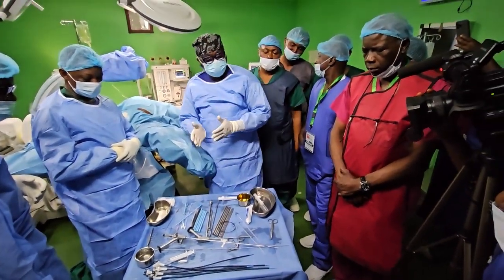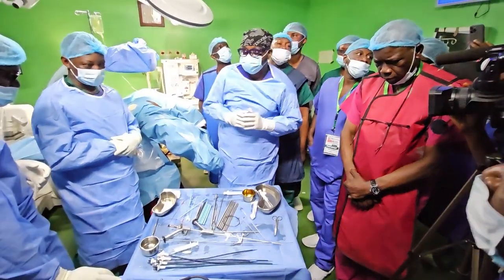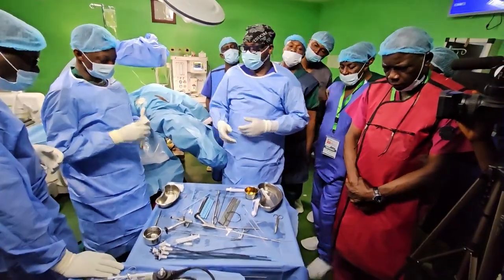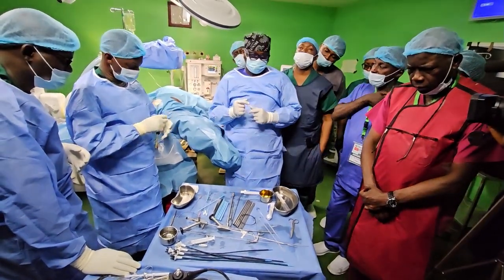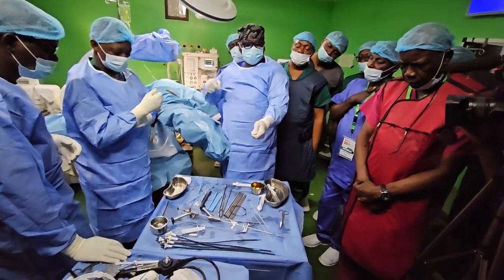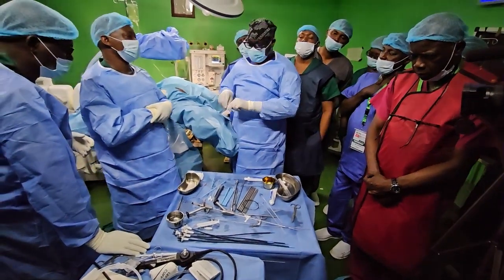The third form of dilatation is balloon dilatation. Balloon dilatation may not look feasible for our environment because it's expensive. Most of them you can only use once or twice, and they are out. But the trick about balloon dilatation is you must preload the appropriate Amplatz sheath on it before you inflate the balloon.